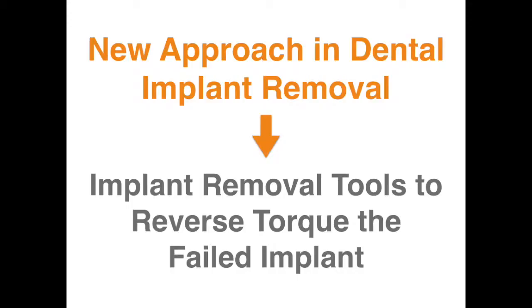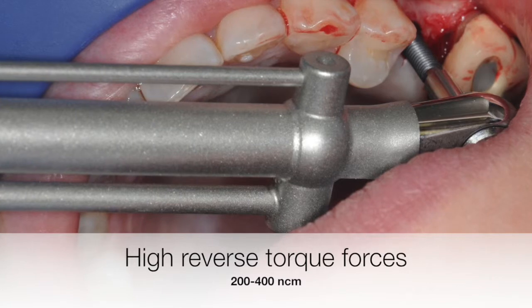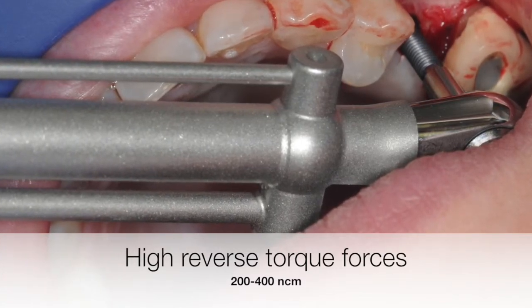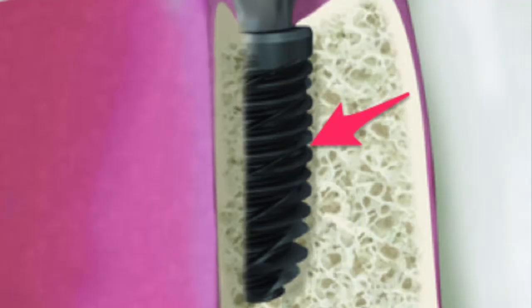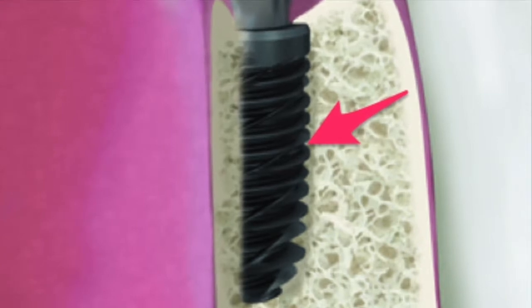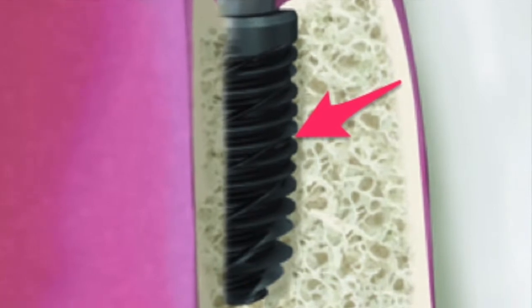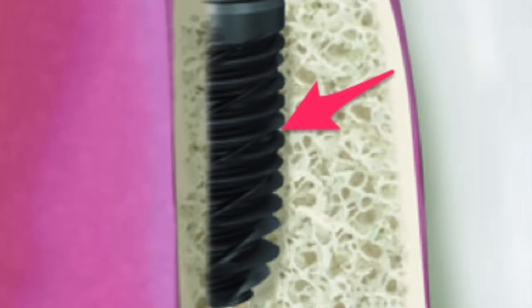A newer technique now allows a much less invasive and less traumatic approach to removing failed dental implants. Utilizing a unique implant removal kit, high reverse torque forces, generally in the range of 200 to a maximum of 400 Newton centimeters, is applied to the implant, which breaks the mechanical bond at the bone-implant interface and allows easy removal of the implant. Depending on the degree of integration, sometimes a much lower reverse torque may be needed.